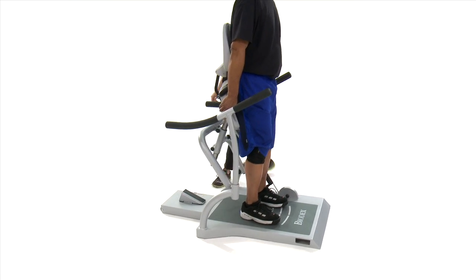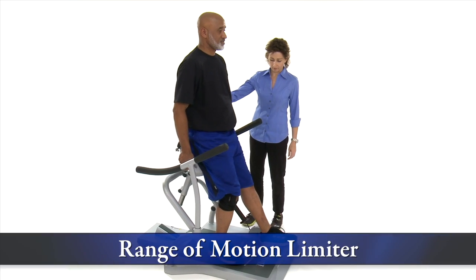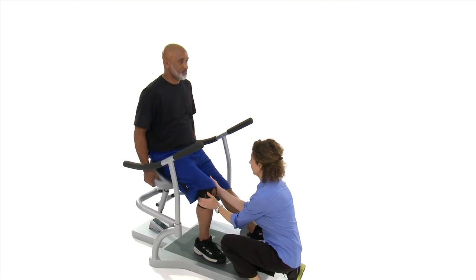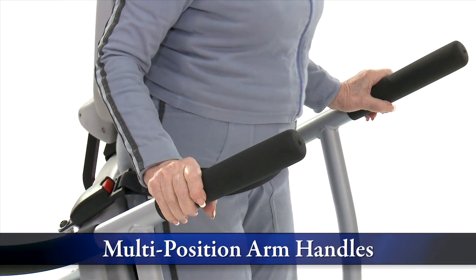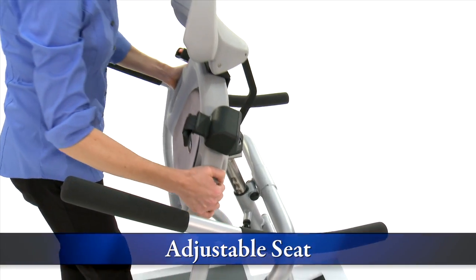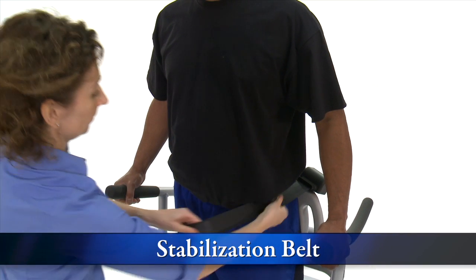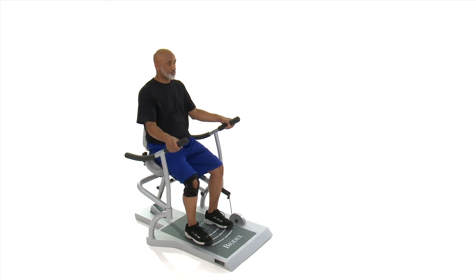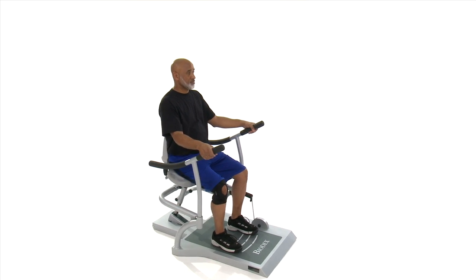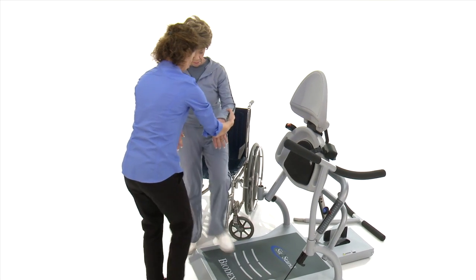For those affected by range limitations or who may be recovering from an injury or surgery, the range of motion limiter reduces the degree of knee and hip flexion. Stability is ensured with multi-position arm handles, an adjustable seat, and a stabilization belt. The combination of these features helps the sit-to-stand accommodate a broad range of sizes and conditions. The arm handles are easily removed for wheelchair access and patient transfer.